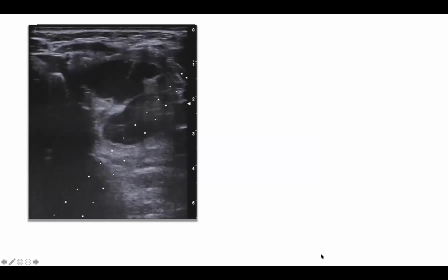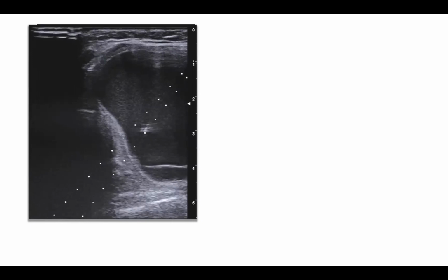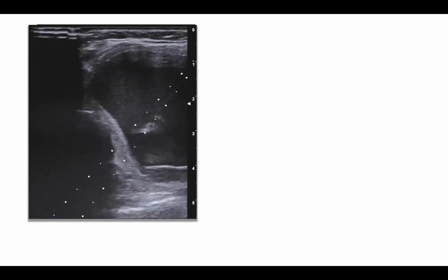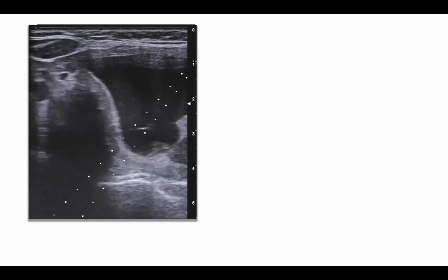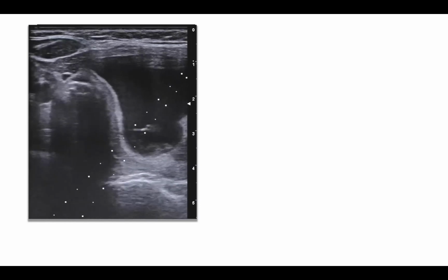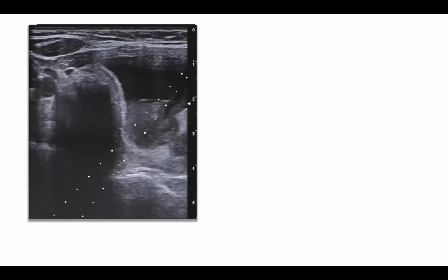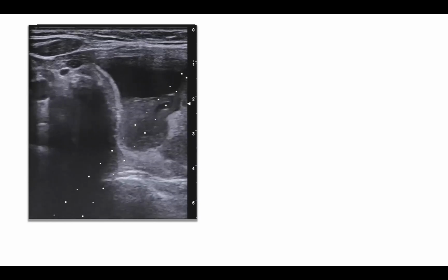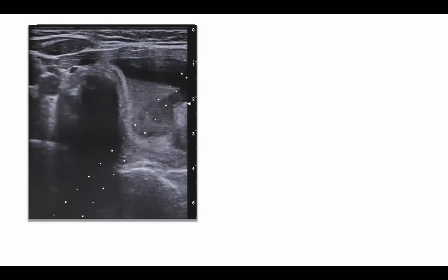This is the real-time procedure described for this case. The initial scroll of the lesion in longitudinal and in axial scan, our attempt to try to get out of the lesion all the fluid before ablating, but as you can see in a moment, the fluid tends to reform immediately.